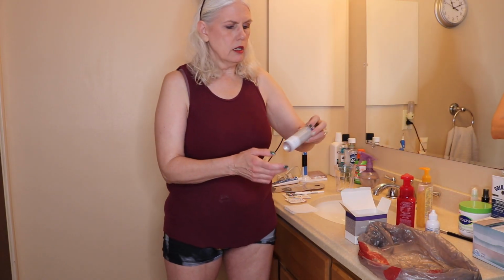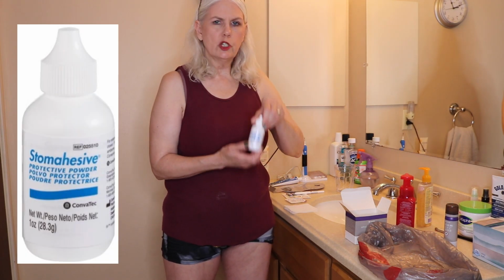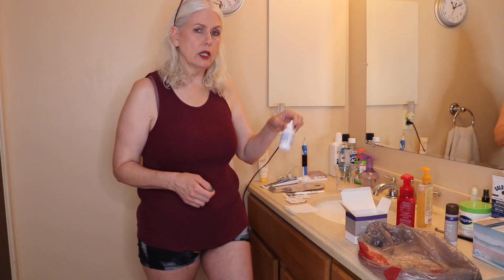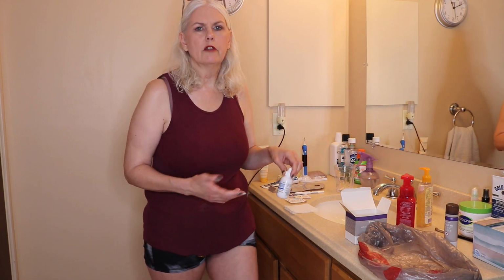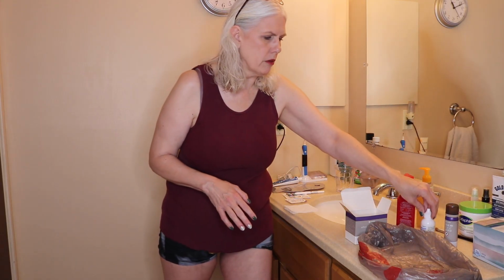I have my adhesive remover spray. I have some stoma powder just in case I need it. I always just bring this in the bathroom with me when I'm going to change because you never know if I'm going to find a red area. Sometimes you can tell, you'll have itching or stinging and you'll know that you'll need to use this. But instead of making a trip back into my bedroom for my supplies, I just bring it every time so that I have it with me.